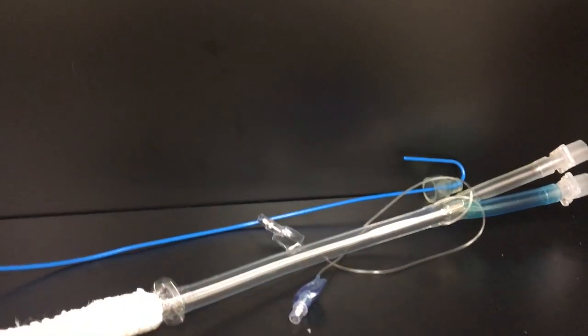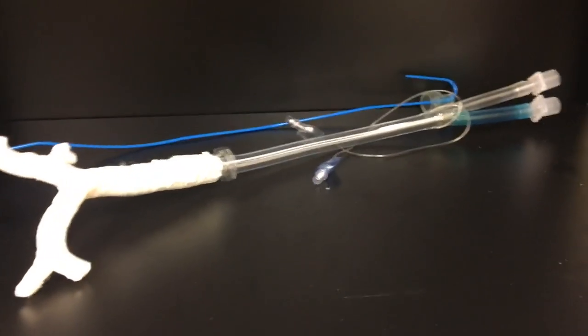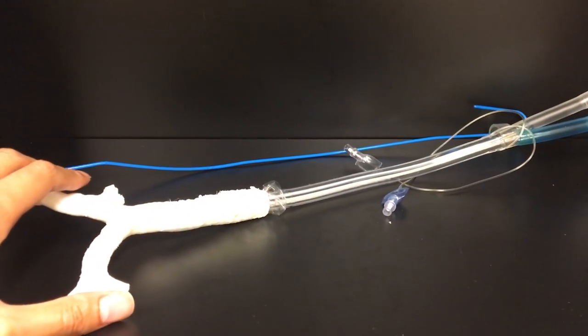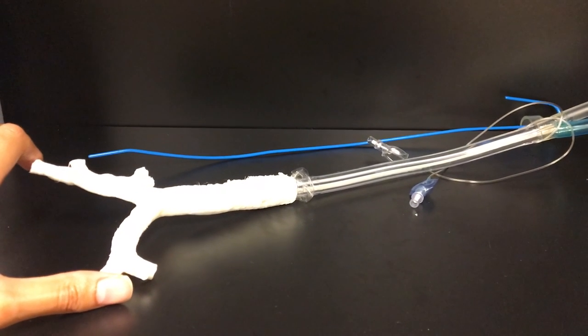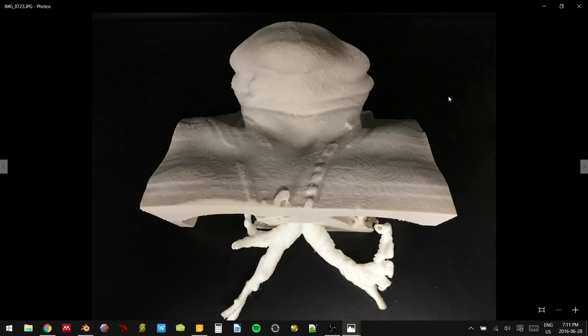And then what you just need now is a way to occlude your airway, and you have yourself a simulator. I will show you some pictures of ours and us actually using it. I wanted to show everybody what a completed simulator actually looks like.